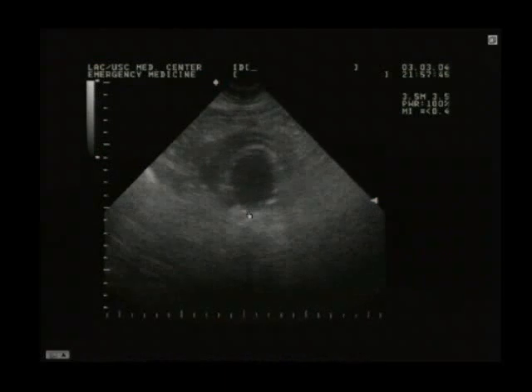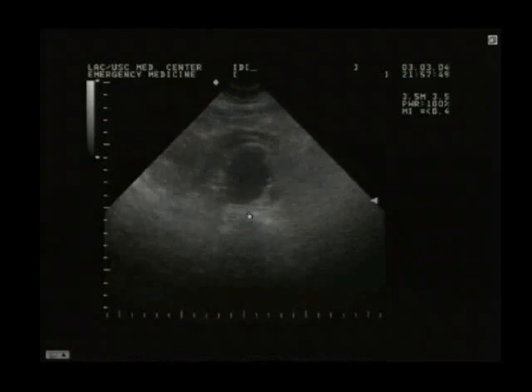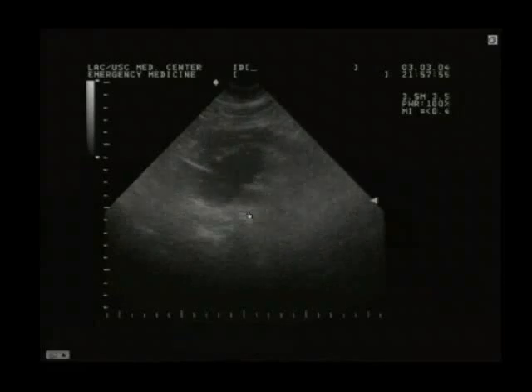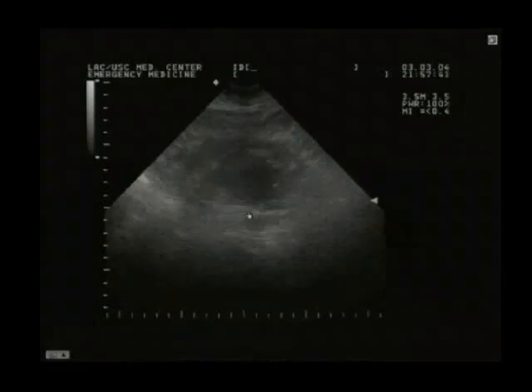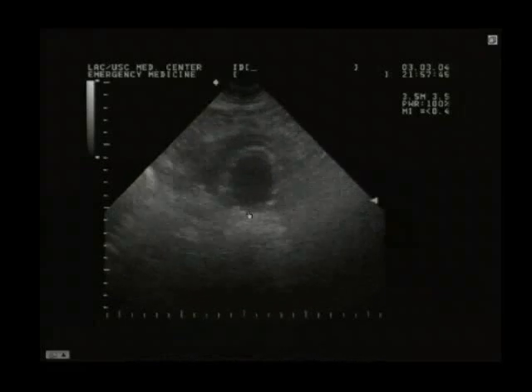Now, you're saying to me, why doesn't that look like that other aorta, nice thin straight line? This is an aneurysm. This is an aorta that's going to be twisted and not in a normal straight up and down pattern. That's why you only see segments of it. That's why it does not look like one big giant aneurysm in one plane. Yeah, question in the back.